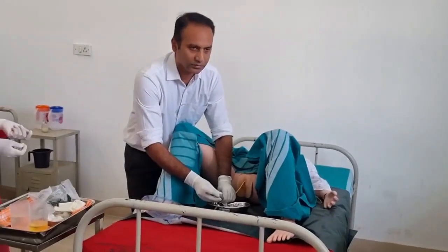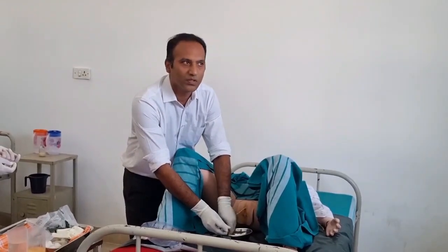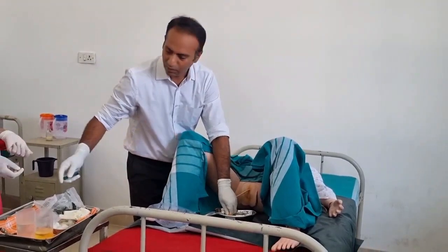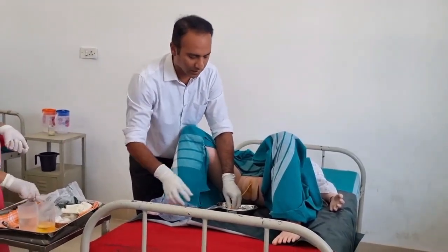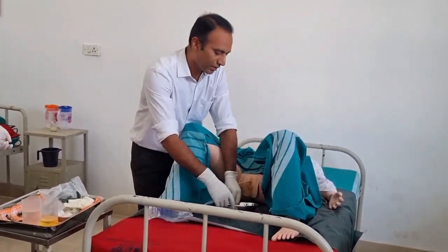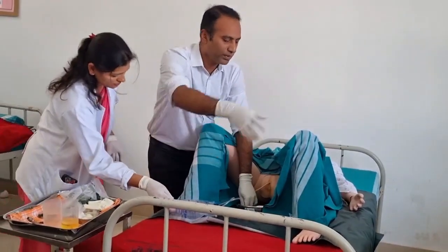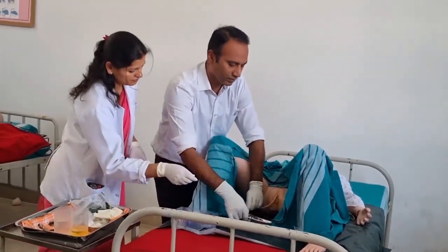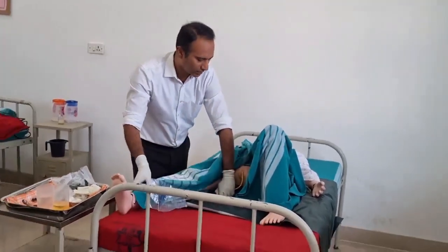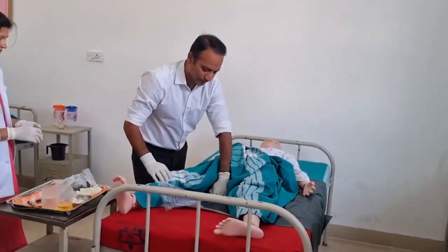Okay, and if she pulls it out, then it becomes an injury, right? Understood? Okay. So this is the method, and then you can remove the kidney tray. Please continue this. You can remove the draping cloth as well.